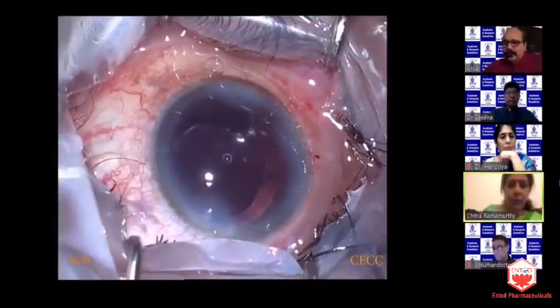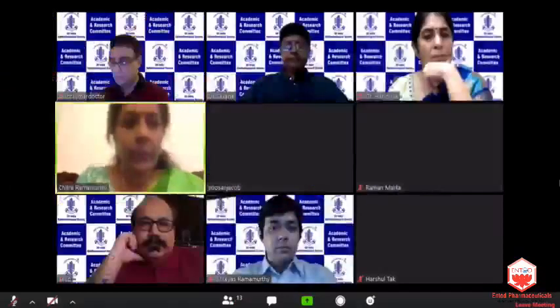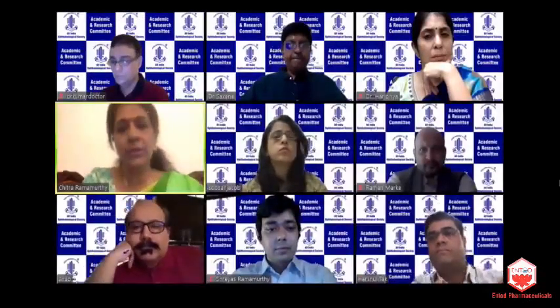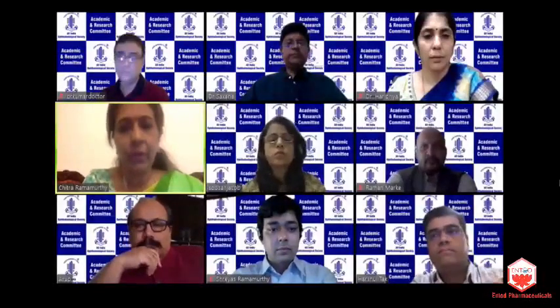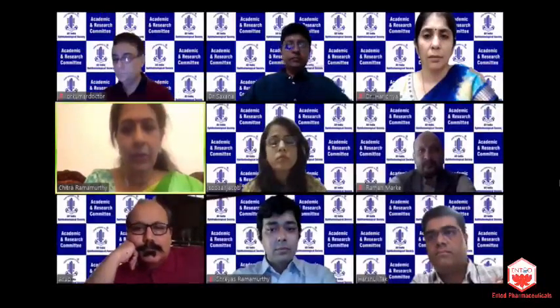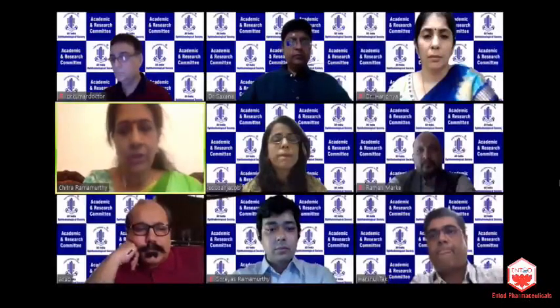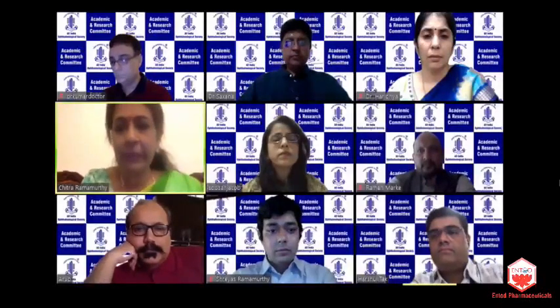Actually, Dr. Kumar Arup, that was a wonderful case, literally a teaching video. But I have two questions here which I'm going to ask you together. I think you would not have had any of these problems, or maybe fewer of these problems, had you given a pre-op mannitol to this patient in the first place. Maybe the IOP was not checked prior to the patient being shifted to the theater, although he would have been medically controlled when you saw him last in the OPD.